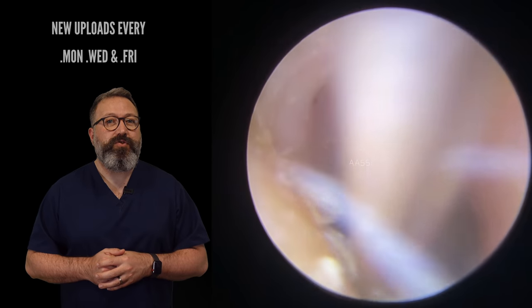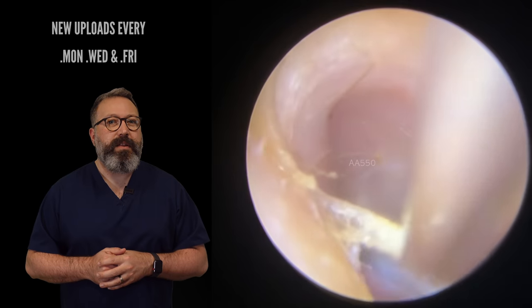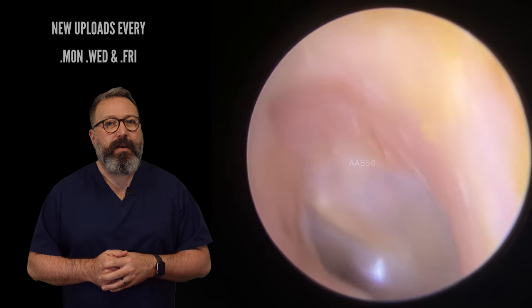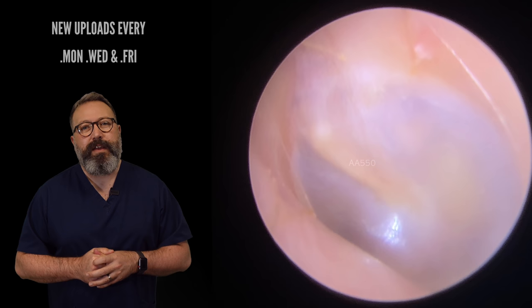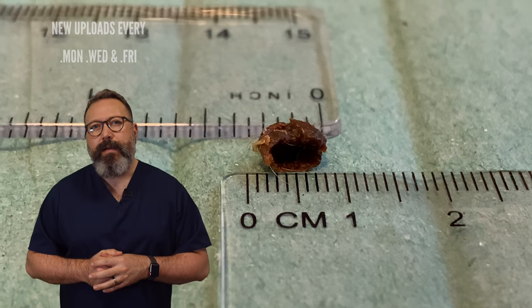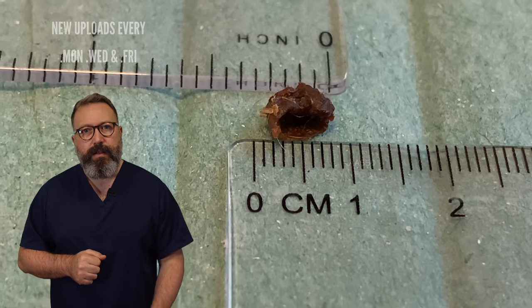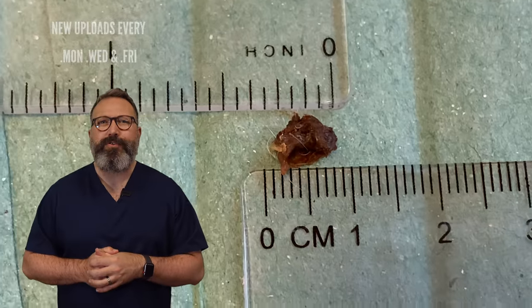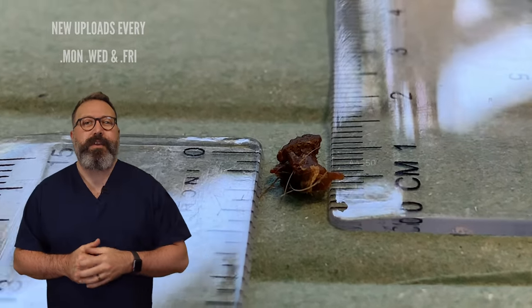I'm just going to struggle with this little bit of dry skin — there we are, it's starting to peel away nicely now. Let's peel it back the other way — there we go. And good light reflex on there as well, so looking lovely and healthy. They're all about a quarter of an inch — just under a centimetre there as well.